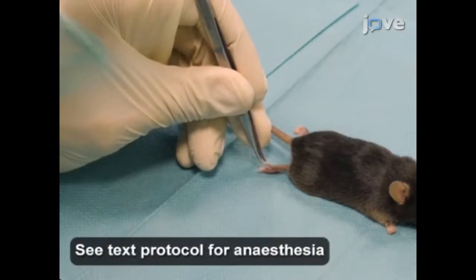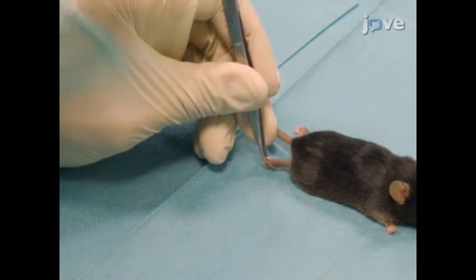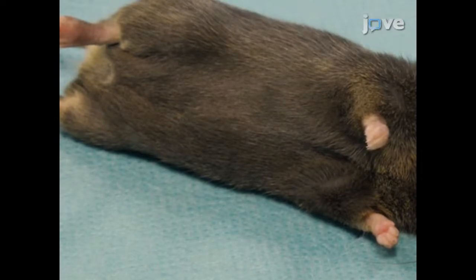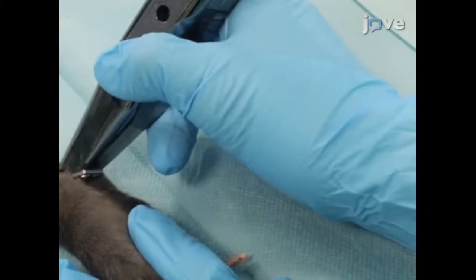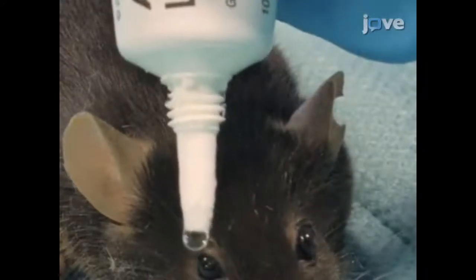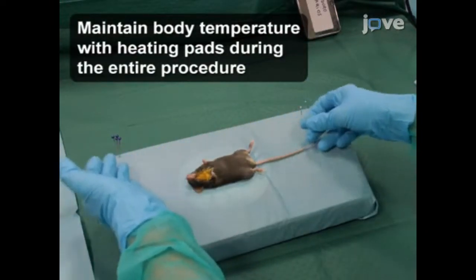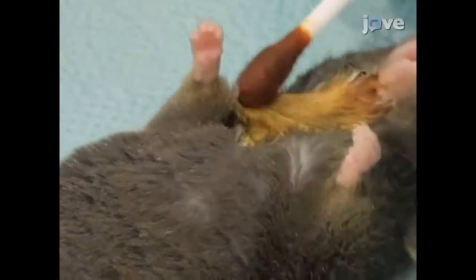After administering anesthesia according to approved protocols, check that a surgical plane of anesthesia has been reached by the absence of a reaction to a toe pinch and the presentation of regular breathing. Use clippers to remove the fur at the ventral surface of the neck and protect the eyes from corneal keratitis with a hydroxypropyl methylcellulose-based gel. Place the mouse in the sterile surgical area in a decubitus supine position. Clean the skin with a povidone iodine-based antiseptic solution and cover with a sterile drape.